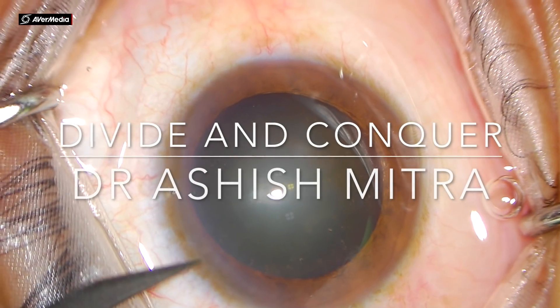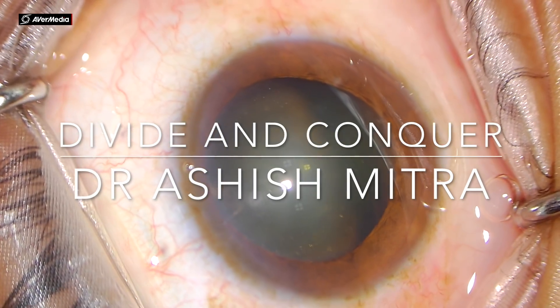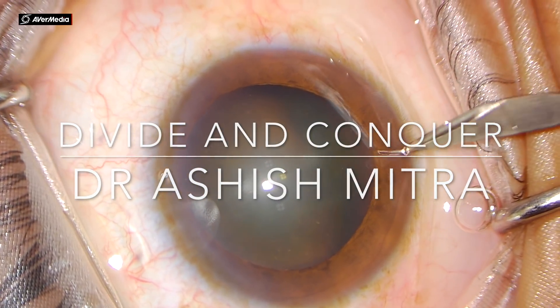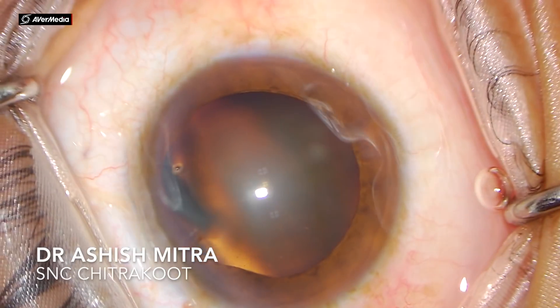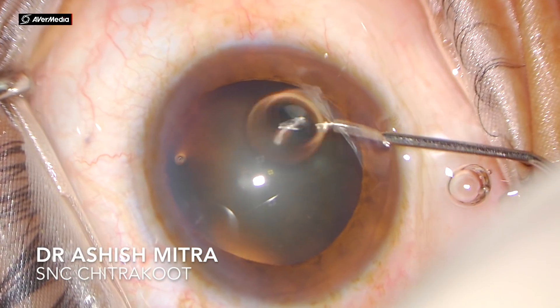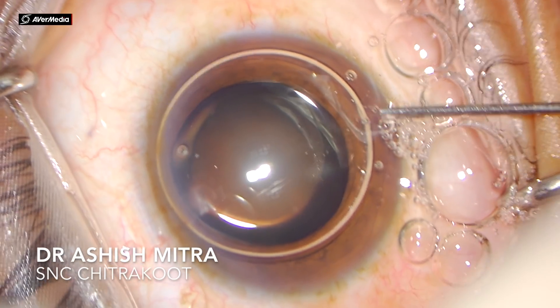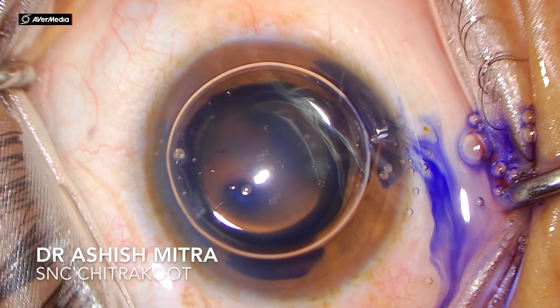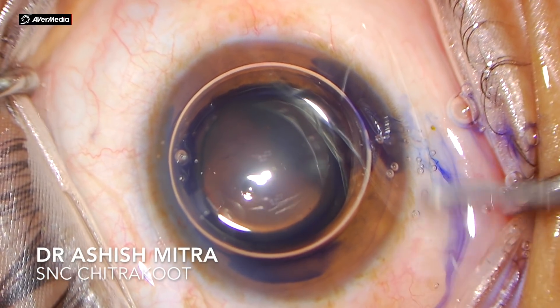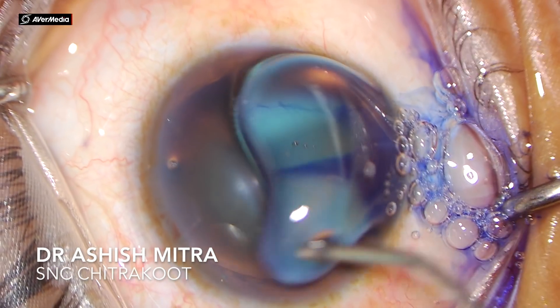Hello everyone, today I am presenting the divide and conquer technique, specially for beginners. Beginners have a lot of difficulties during their initial learning period and they have a lot of queries as to how to do the steps of surgery in a manner that they don't land up in complications and are able to do the surgery completely and successfully.